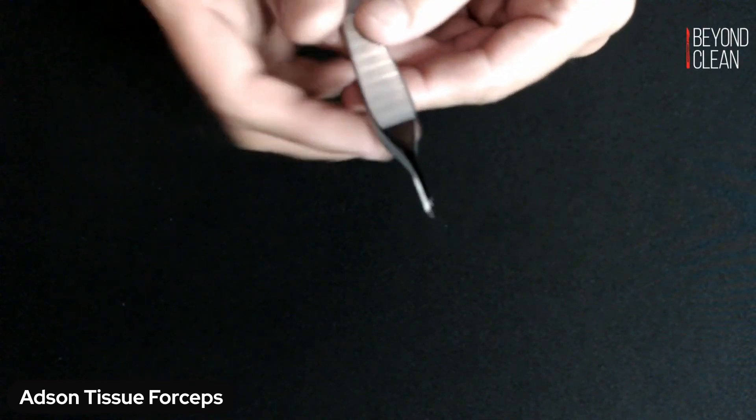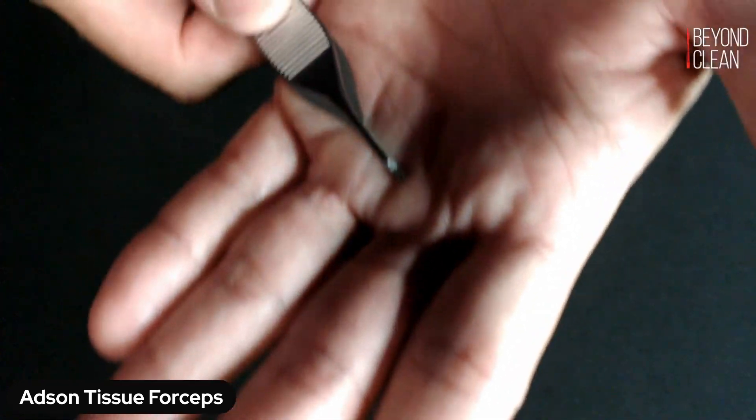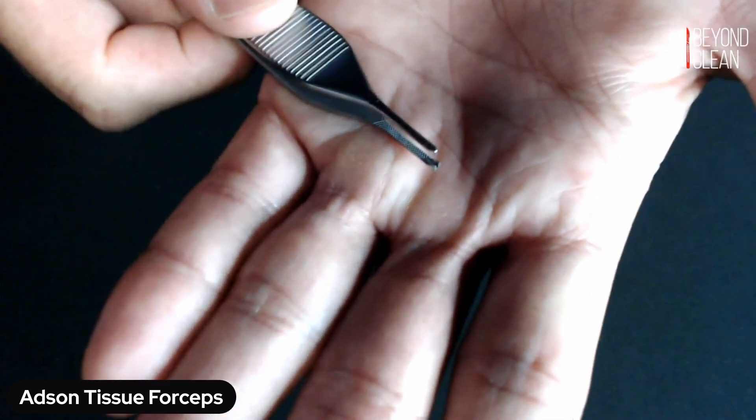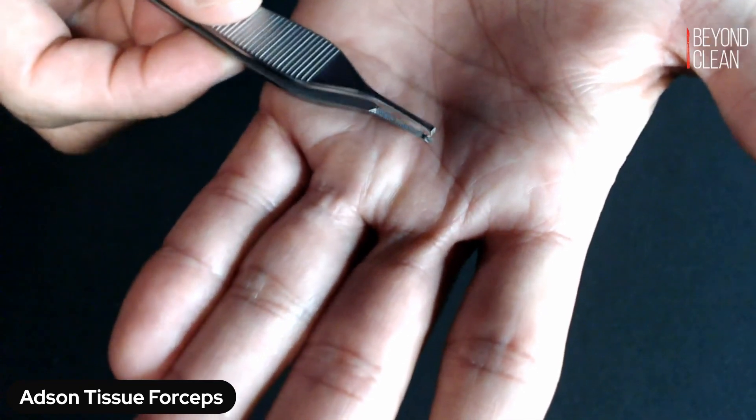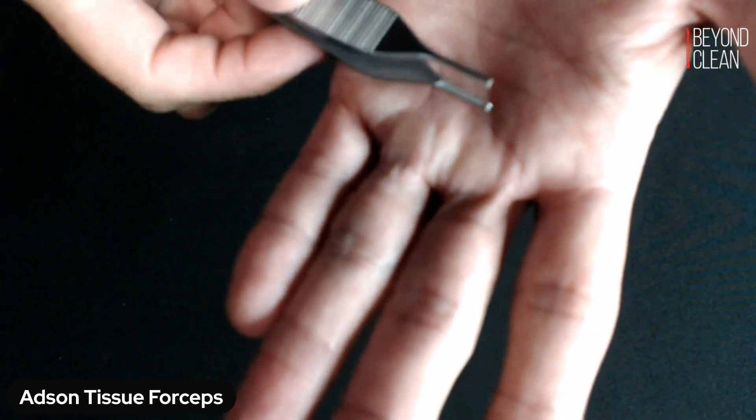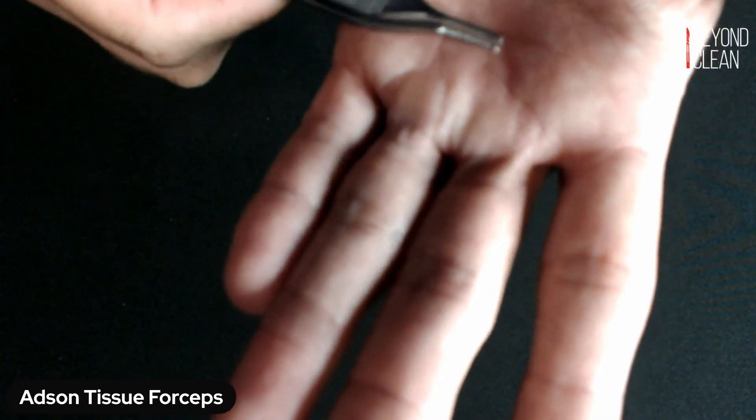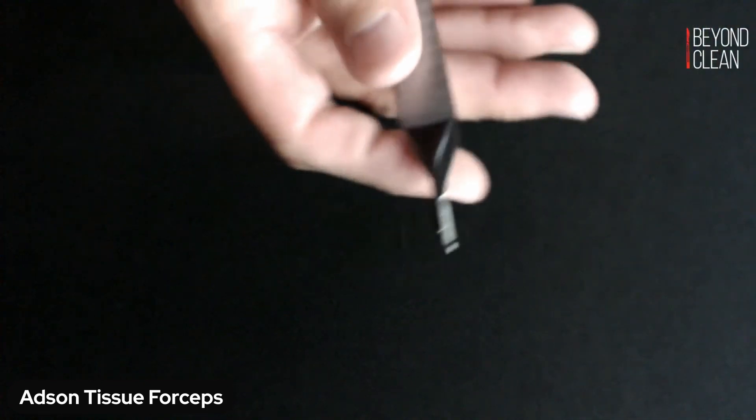Anytime you're looking at forceps, like we've said in other videos, you're going to want to make sure that those jaws are aligned, that they're closing straight on top of one another, that you're not seeing any overlap as you close, that you're not hearing a click as you're closing them and not feeling any resistance.